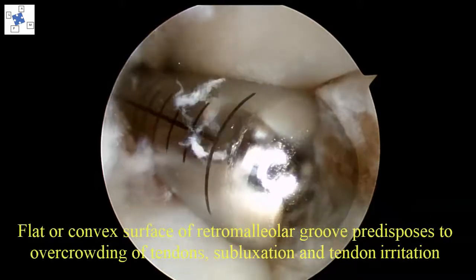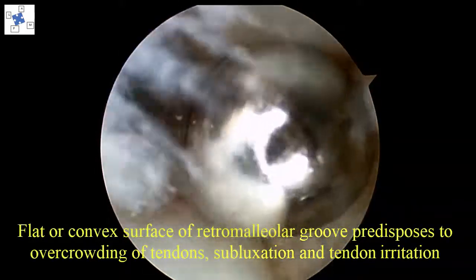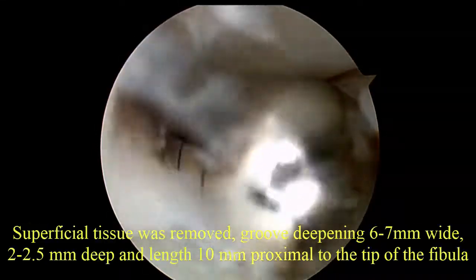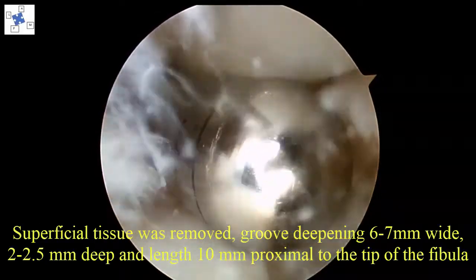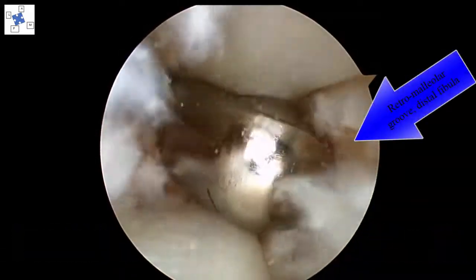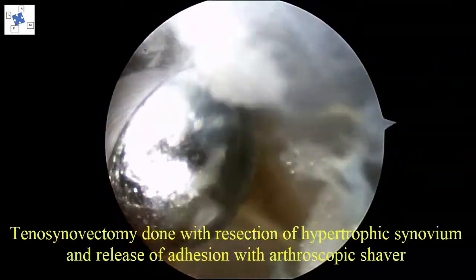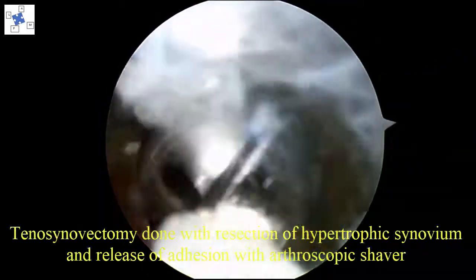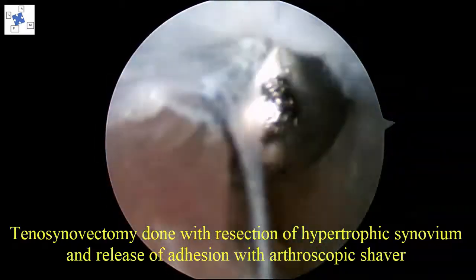The superficial tissue of the groove was removed, about 6 to 7 mm in width, 2 to 2.5 mm in depth, and a length of 10 mm proximal to the tip of the fibula was made, which was judged by the diameter of the shaver, which was 4.2 mm. Tenosynovectomy was done with resection of hypertrophic synovium and release of adhesion with the arthroscopic shaver.